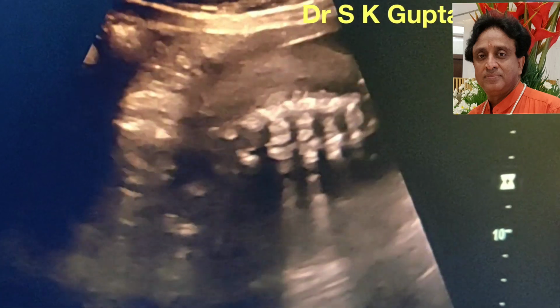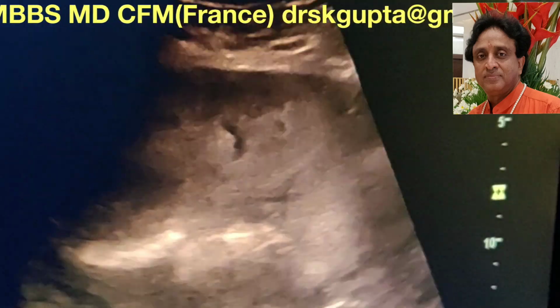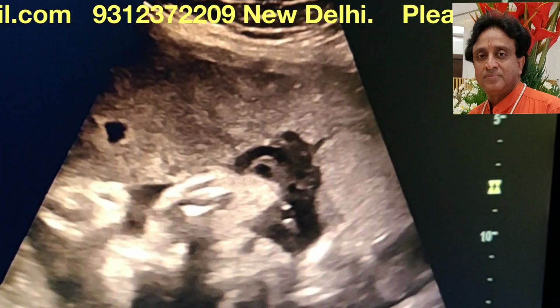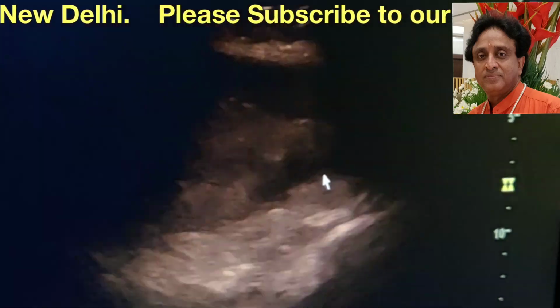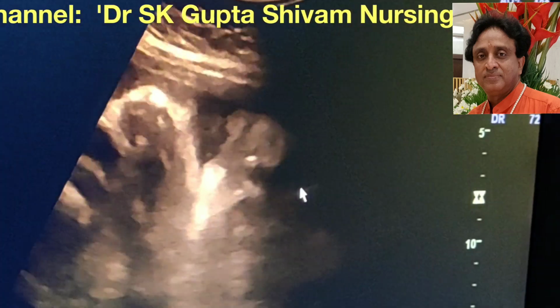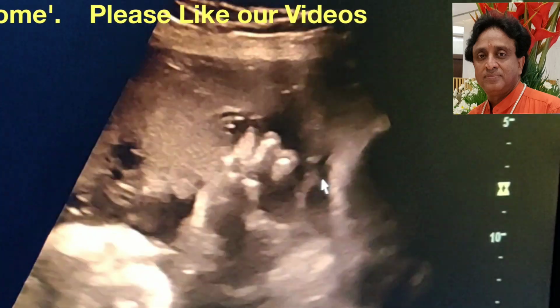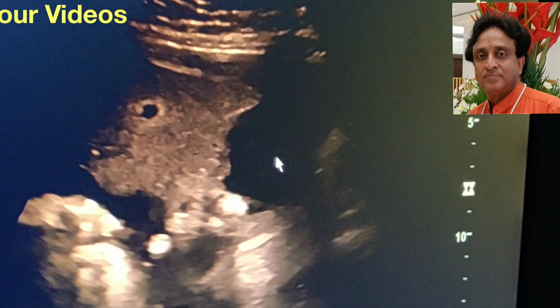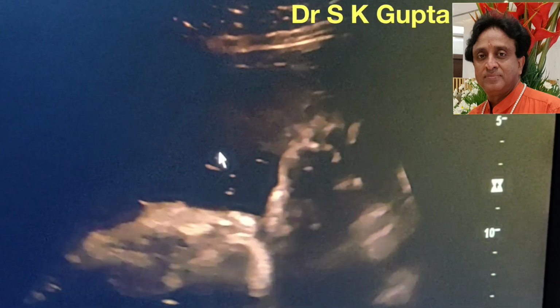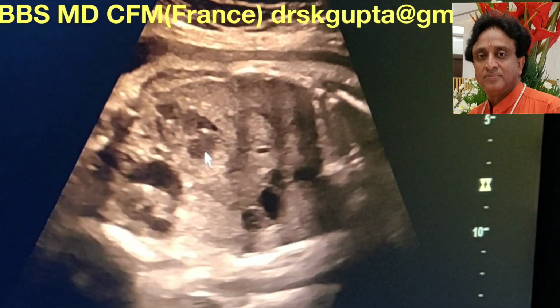If we are seeing that the kidneys have a problem, we should always try to look at the liquor. Let me show you that the liquor pockets are well seen. This is a good liquor pocket here, and liquor is well seen over here also, and here also. Apparently the liquor is there, and it seems reasonably adequate. There is no oligohydramnios for this gestational age.